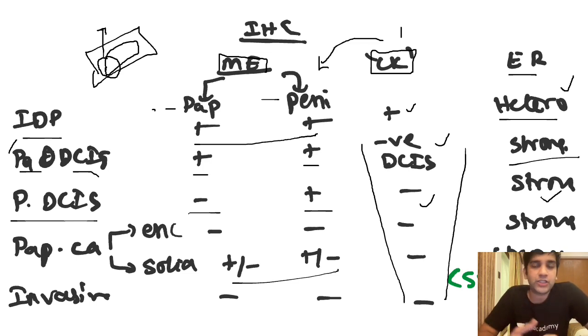That's how the WHO explains them. That's how it will look. Don't think they are benign. It will be patchy here and there. So solid papillary carcinomas will have a patchy expression, maybe sometimes completely negative. But what tells me it is still malignancy is a complete pitch dark negativity for my cytokeratin 5 or 6 and extremely strong ER positivity.